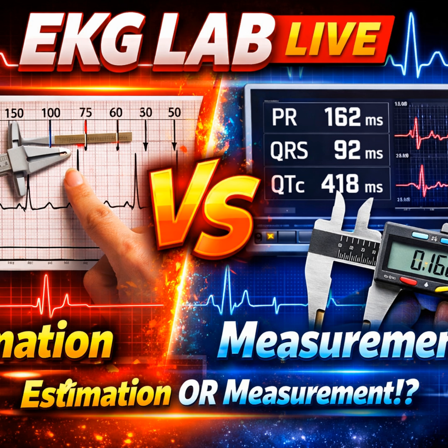Agreed, it is not sensitive. But if I see that pattern and I know the patient just got off a long-haul flight, or is a young woman on oral contraceptives, information you would ignore in your blind reading, I have a working diagnosis in seconds. While you are calculating the axis of the QRS complex to the exact degree, the patient is throwing a clot. Analytic strategies are slower and prone to analysis paralysis during a crisis.